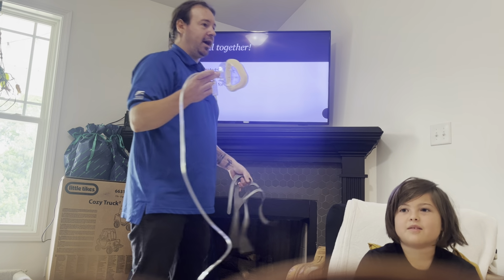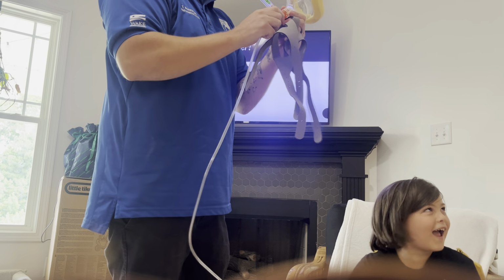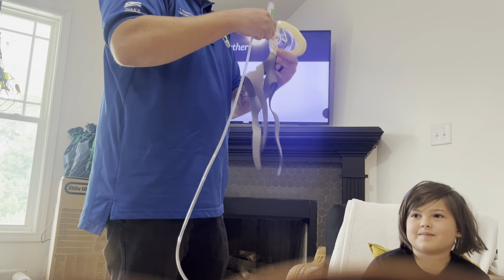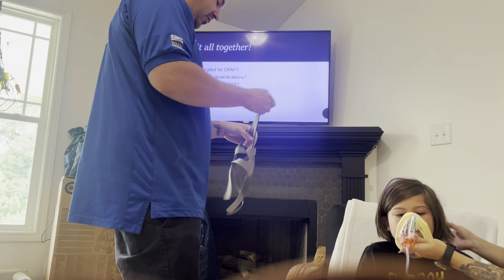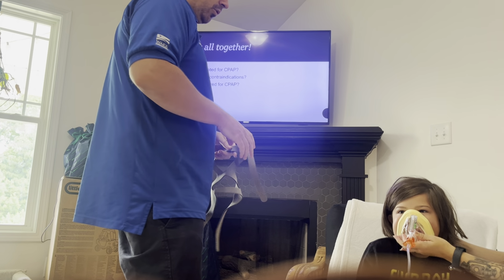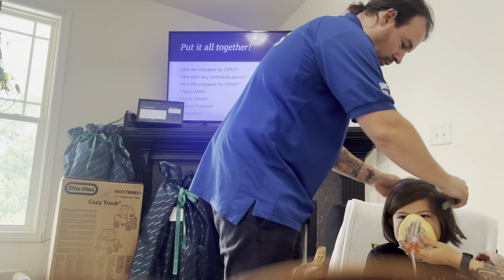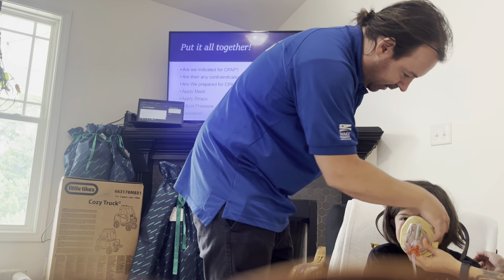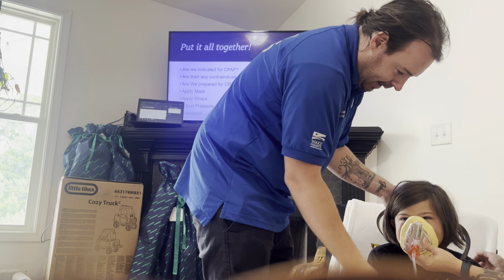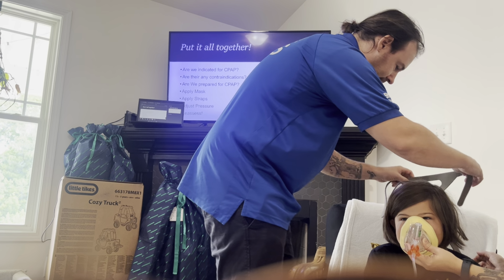All right, and I'm going to have my lovely wife be the single provider who goes ahead and applies the mask. So we've connected it to our oxygen source. We've got oxygen going so that the patient is going to receive oxygen, but we're not all that concerned about the pressure just yet. So while she's holding it, we're going to check and make sure we got a good seal. I'm running my fingers around it. I'm not seeing any of the leaks in this seal. That's a good sign. Okay?